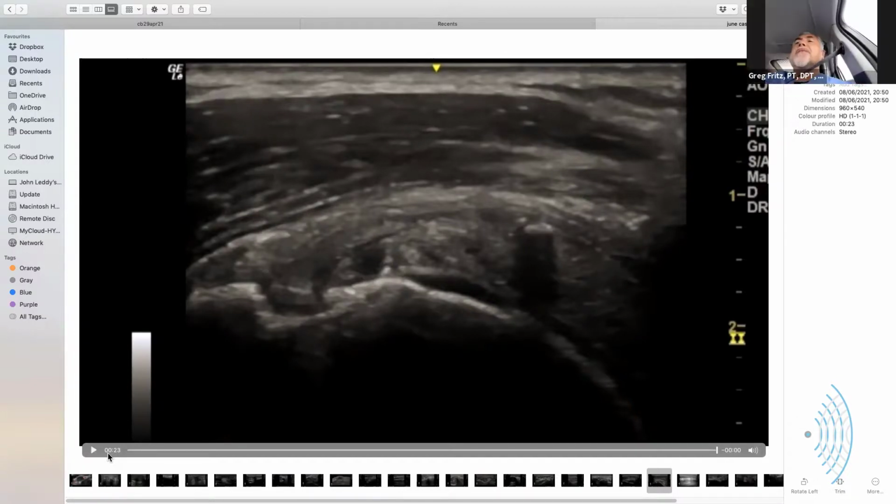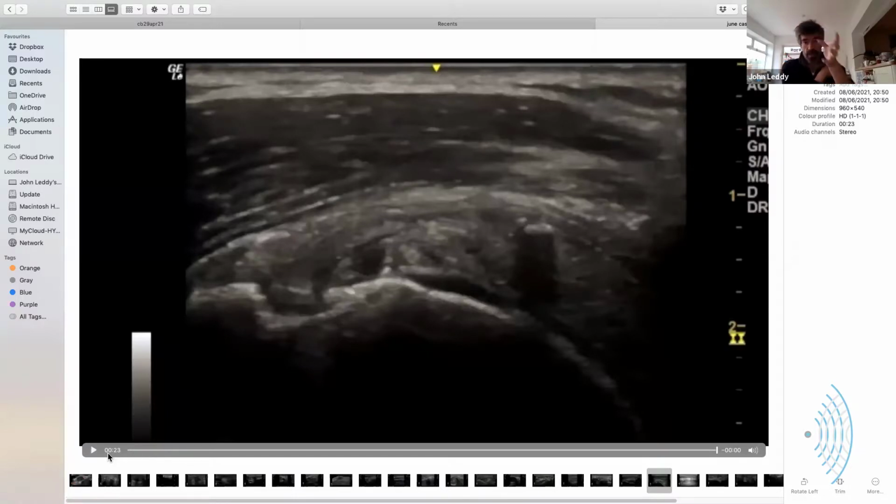And are you then going from the same position that you're looking at the posterior labrum and glenoid and the back of the humerus, and you're coming at the middle facet that way? Yeah, but then typically I go into short axis, and I try to follow it from round the joint. I pick up the tendon tissue round the joint line, and then you follow it up. Sometimes it disappears completely under the acromion, but particularly if you put the arm right across here, you can often follow the infraspinatus round and get a view as to how much of it is torn. That's really what you're looking at.